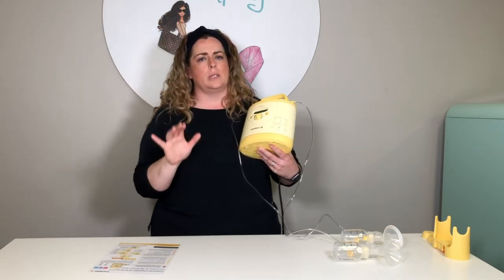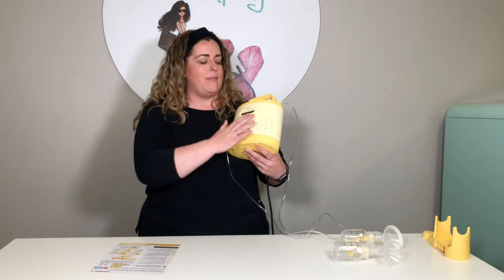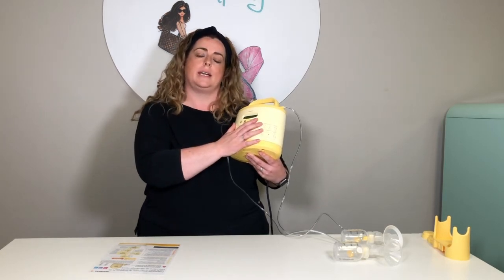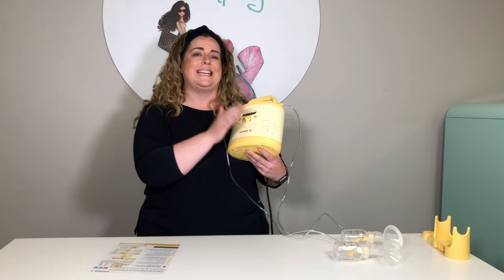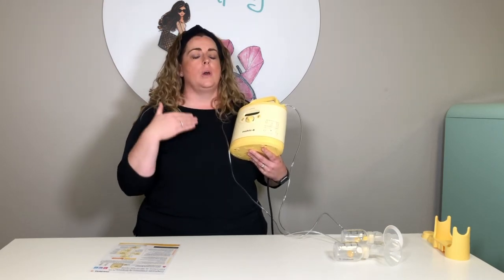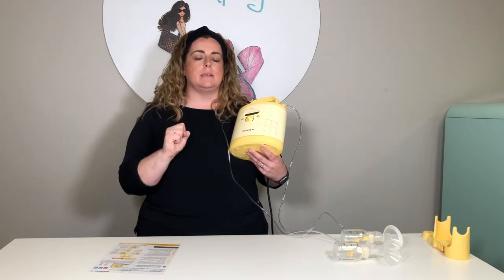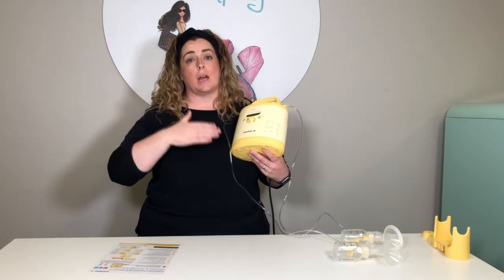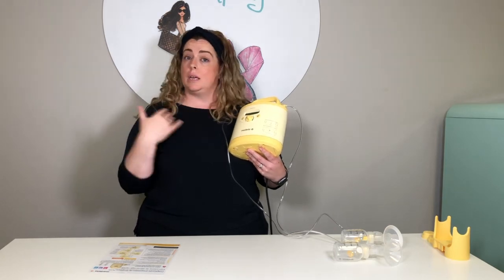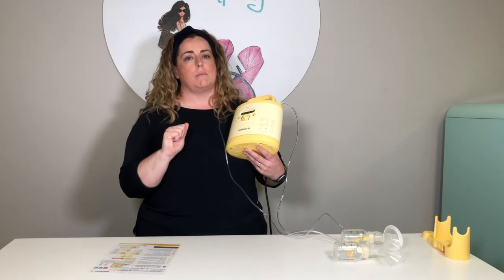So it's very important to understand that in the very beginning, you're not going to be pumping a lot of milk, and that's what the initiate button is designed to do. The technology in this pump is designed to give you the ability to initiate your supply. Once you are pumping roughly 20 mils at a time, and you can do that in a couple of consecutive pumps, combined pumping of course, then you can move over to the maintain program.